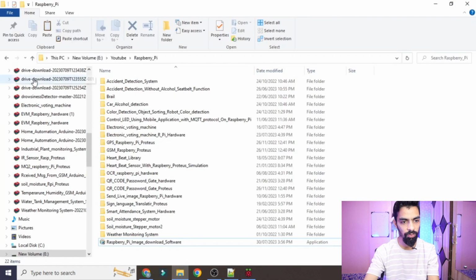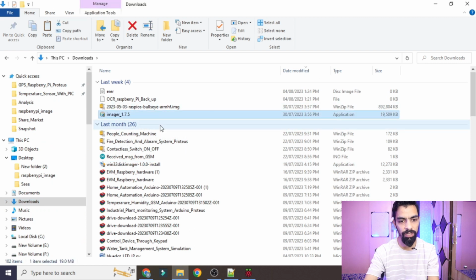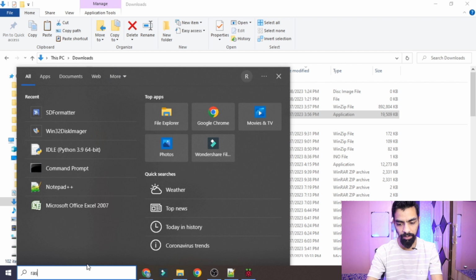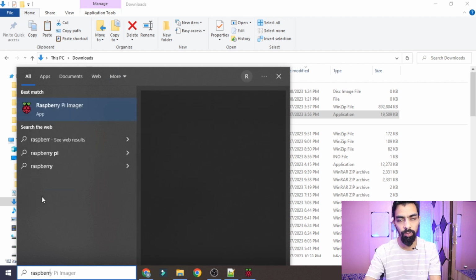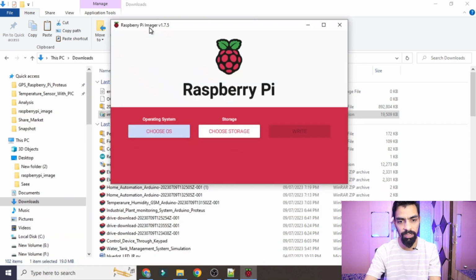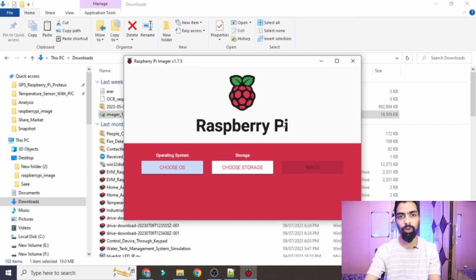Once I click on this, you can see it in the downloads. In the downloads you can see this software, which is an application file. You have to install that software. Once you install that software, go to your start bar and type Raspberry Pi Imager. Once you type Raspberry Pi Imager, click on it. Once you click on it, this software will open. Then after that, what you have to take?